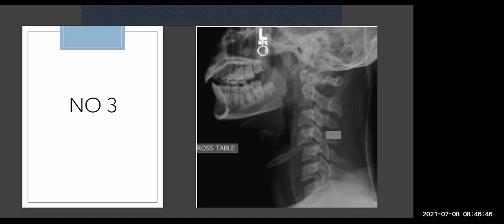Very good. Okay. Now compare this to the previous one where we were kind of debating whether it's moved or not. This is obviously moved out of place. All right. So this is moved quite far out of place. And then we look at the middle line. And what do we notice again?